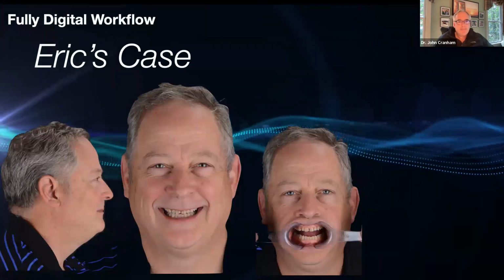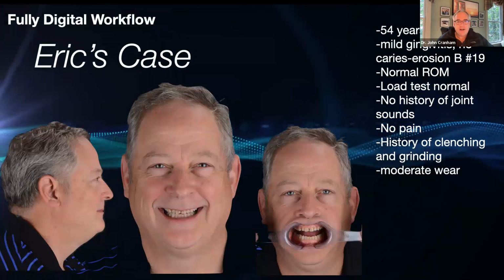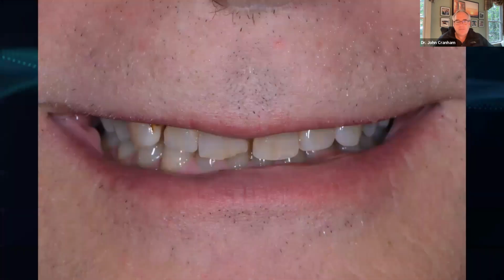All right, so let's look at a sample case and then we can wrap up. Eric, 54 years old, mild gingivitis. He's got good stable joints, no pain. He's got a history of clenching and grinding, moderate wear, deep bite, no mobility, and would like to improve his smile.